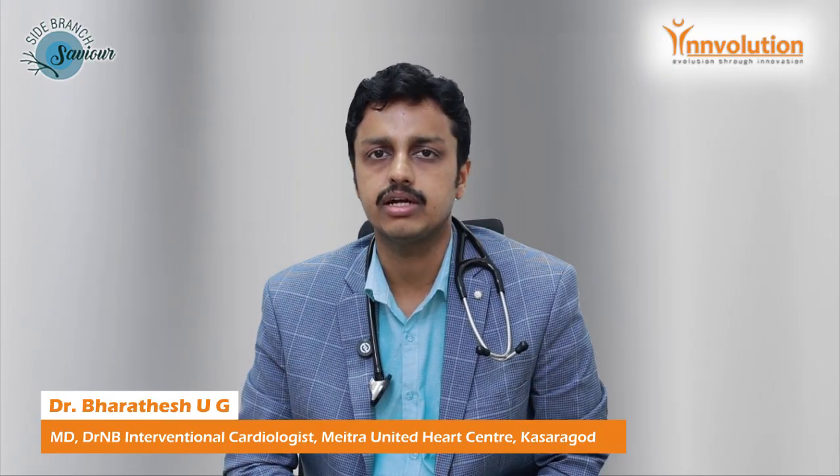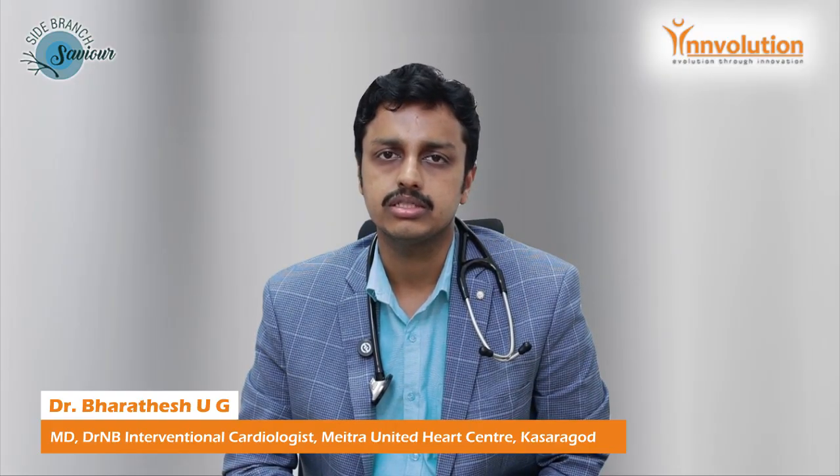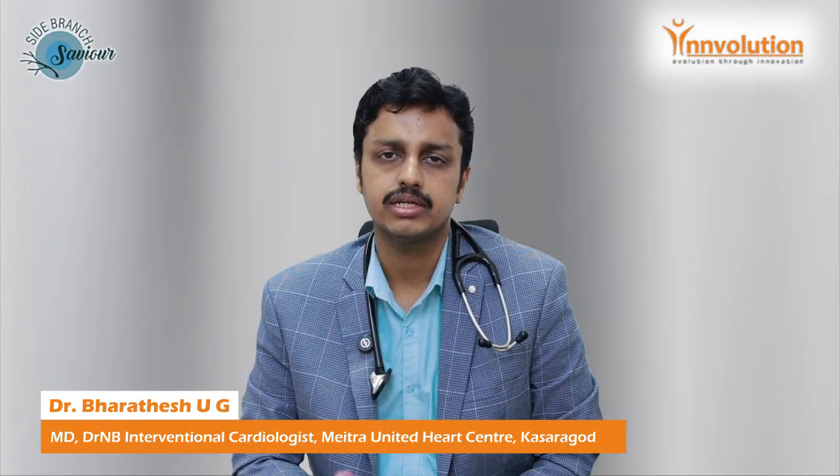When you do a left main bifurcation, optimal post dilatation by kissing technique, using two balloons, it is called the kissing technique. Along with that, you have to do a POT. This helps in preventing restenosis, giving a good result to the patient. I would prefer to use an open cell design with a good expansion capacity as a side branch saviour.